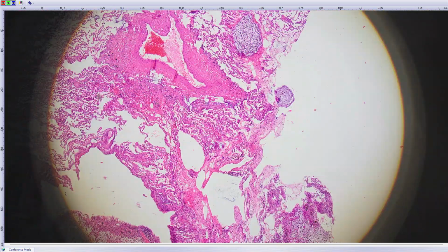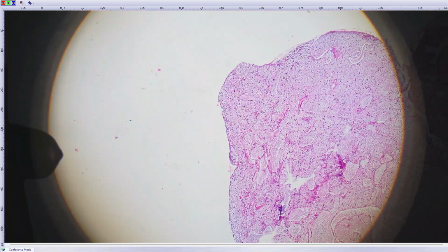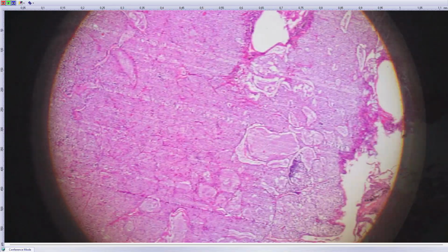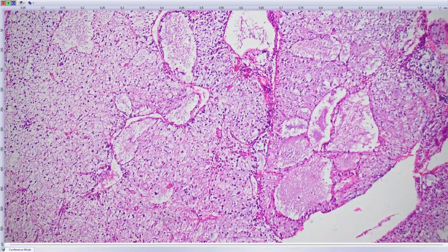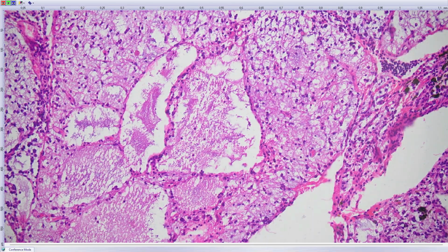Okay, I will start with the first case. I start with an amazing new thing in human pathology. It is a lung tumor with such mucinous tumor, for which the typical occurrence are these lakes, or these big structures that remind similar lakes that can be sometimes seen in myxoid liposarcoma.